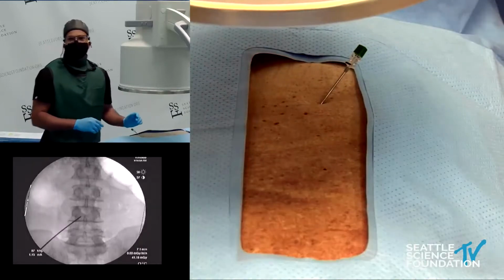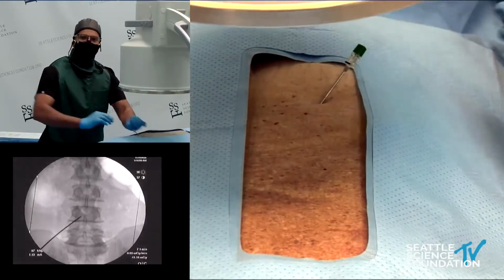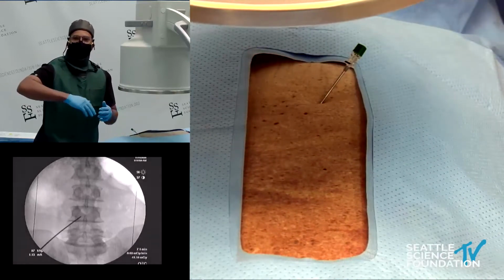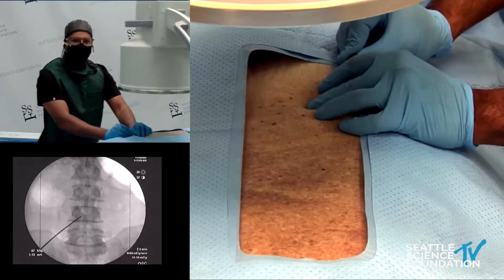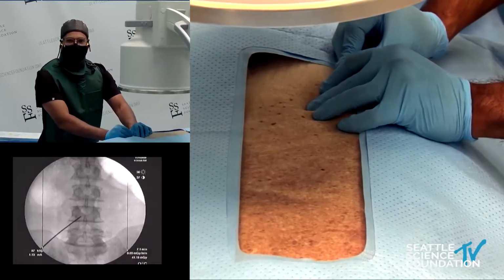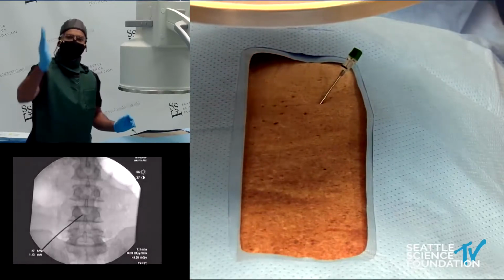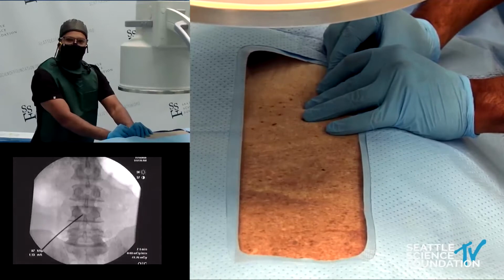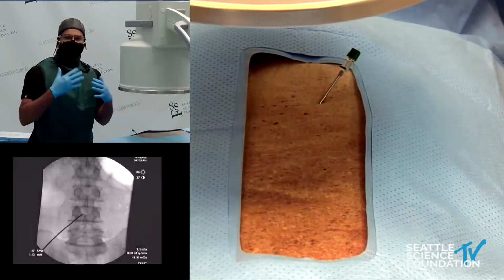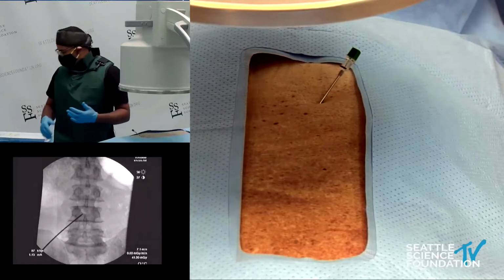So you can see here what I'm doing is I'm coming off the lamina. And right now, if we extended that line, I'd be coming underneath the foramen. So that's not quite ideal, but I'm touching bone just so I know my depth. And now I'm starting to shift my angle more cephalad, so it's going to start to steer towards that neuroforamen. So what I'm going to feel for here, which you can't really appreciate via Zoom, is that I'm going to fall off that lamina and really start to enter the epidural space.